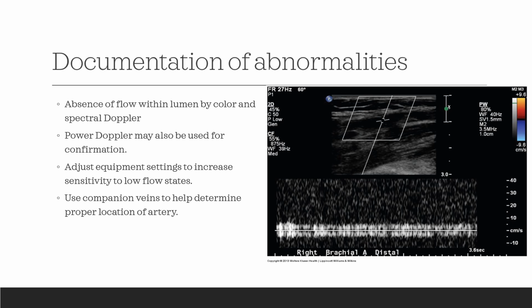You're going to pull out all the stops to try and get any flow that may still exist within a stenosis, because that would indicate that the patient may still be operable. Once that flow is completely occluded, they are no longer operable. So your ability in this area to find that flow, if it does exist, is going to be essential.